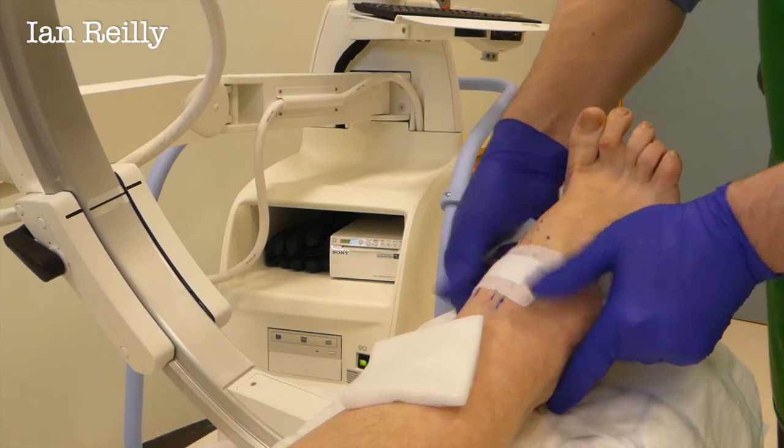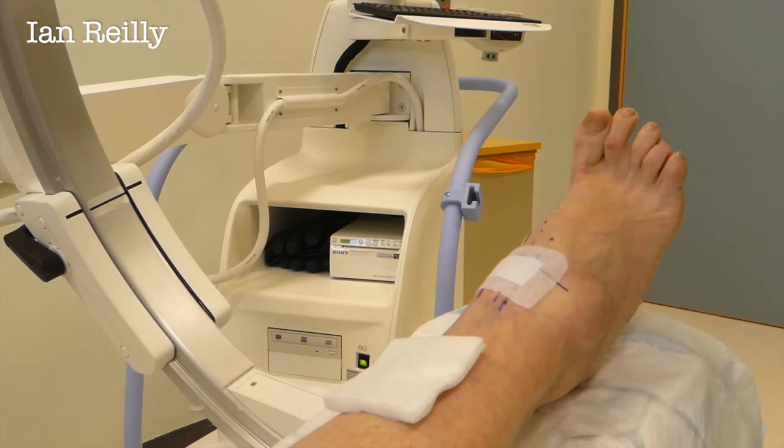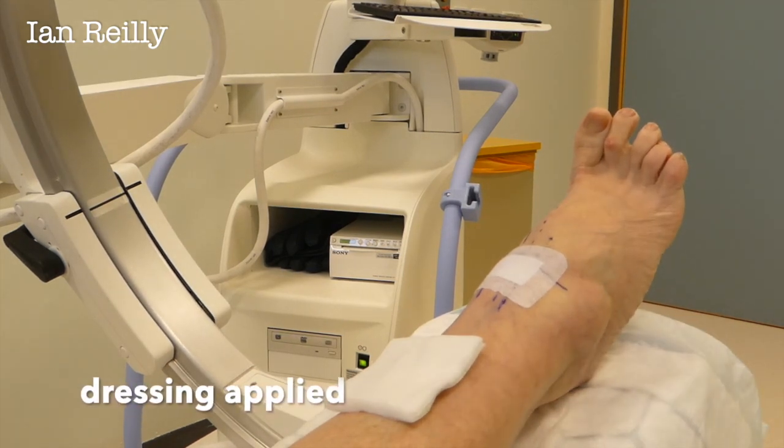If it takes away the pain, that'll last for an hour or two, and then the steroid will kick in.